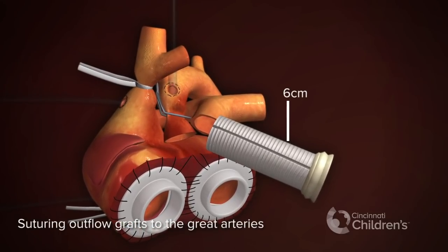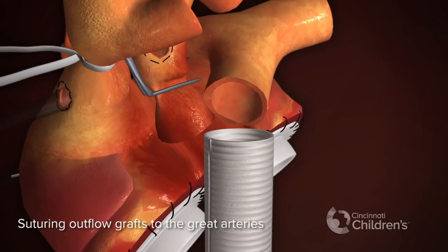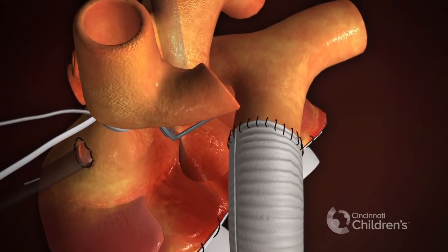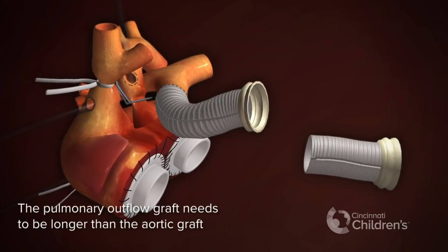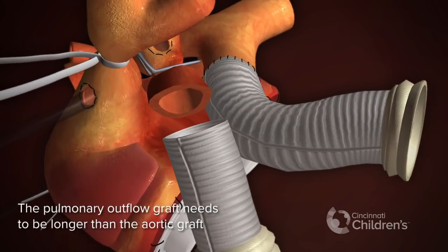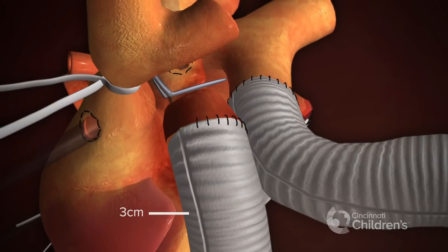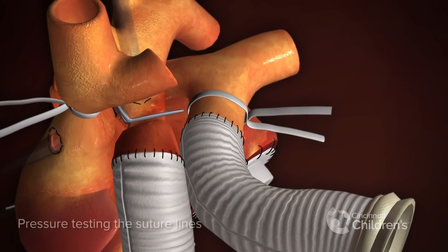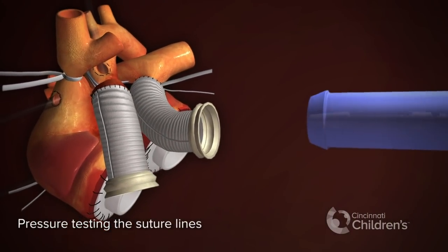Suturing outflow grafts to the great arteries. First, the pulmonary artery graft is sewn into place; it is typically six centimeters in length. The pulmonary outflow graft needs to be longer than the aortic graft. The aortic graft is typically three centimeters in length. A snare or clamp is placed on the pulmonary artery, and then pressure testing the suture lines.